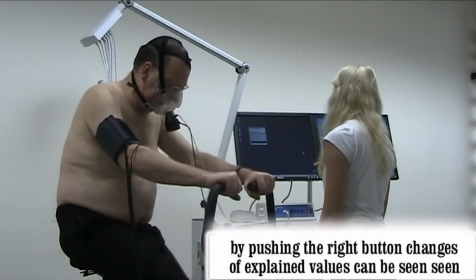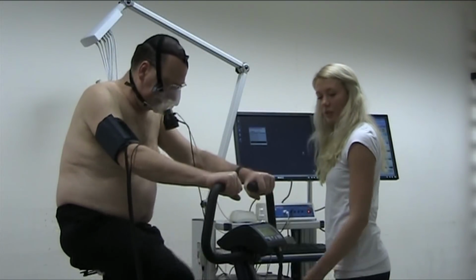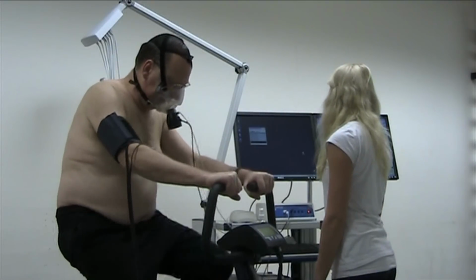By looking at the values, you can see that the patient has reached VO2 max. The CO2 is higher than O2, and the minute ventilation and the heart rate have increased significantly.